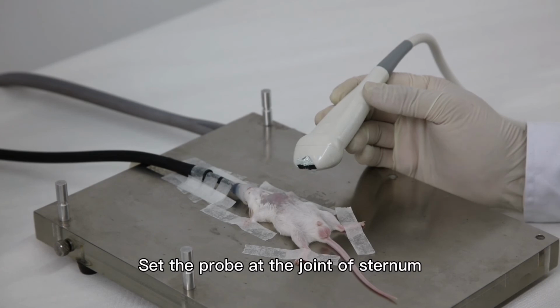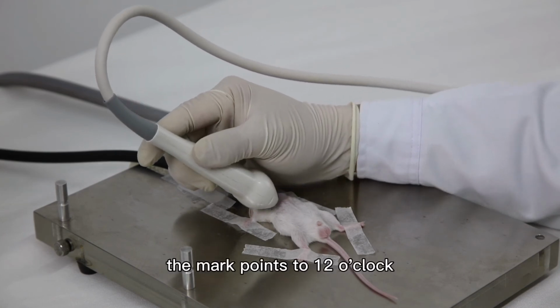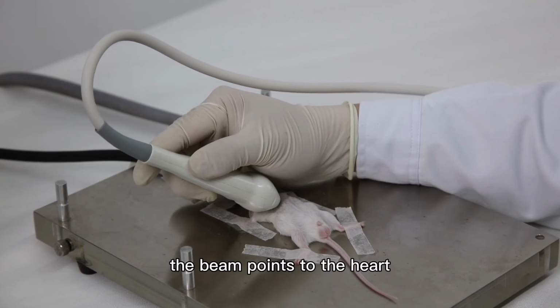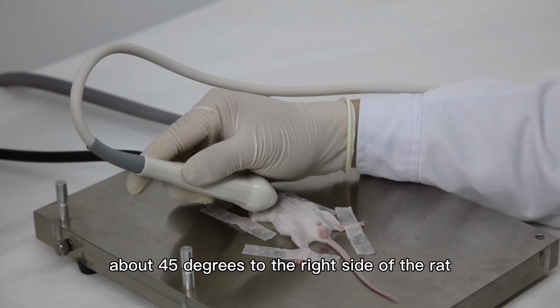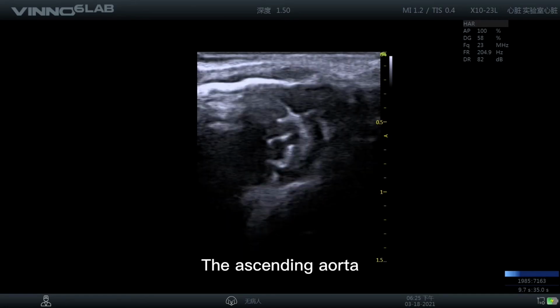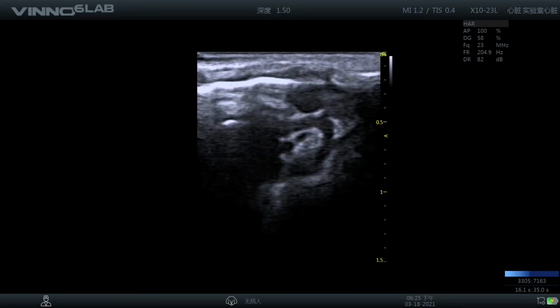Aortic arch view. Set the probe at the joint of sternum and right costal cartilage. The mark points to the 12 o'clock. The beam points to the heart. The tail end inclines about 45 degrees to the right side of the rat. The ascending aorta, descending aorta, aortic arch and branches will be shown in the image.